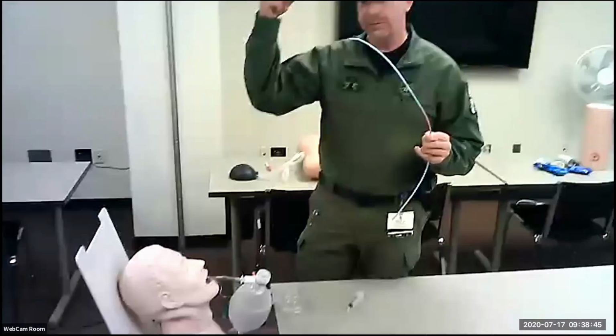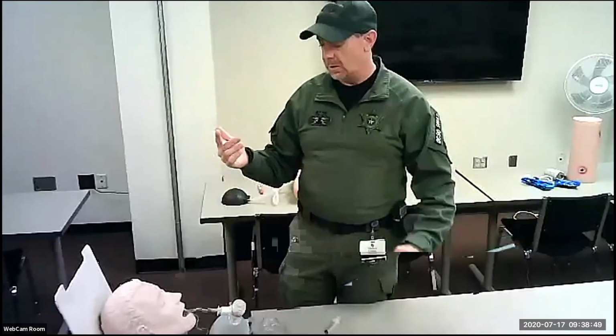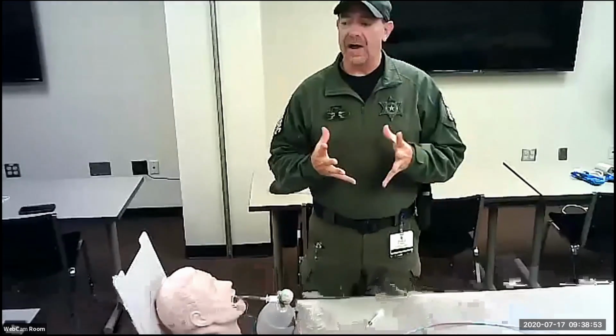First thing is actual visualization. I actually physically see my bougie pass through the vocal cords. I saw it. I know it's not anywhere else. The second thing is going to be end-tidal CO2, end-tidal capnography.